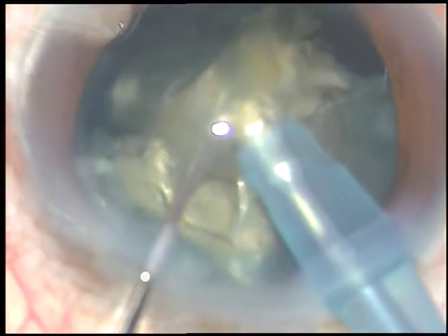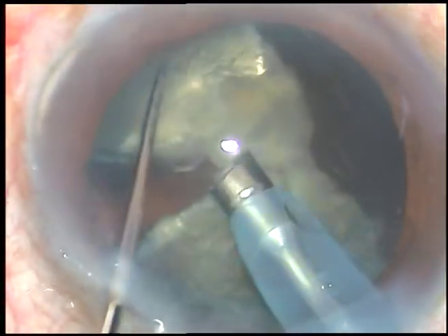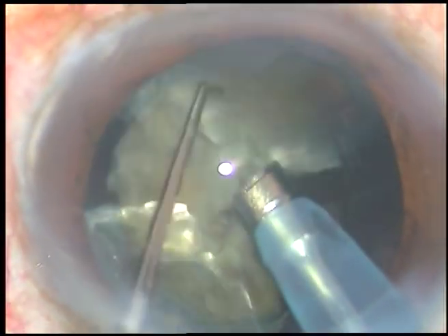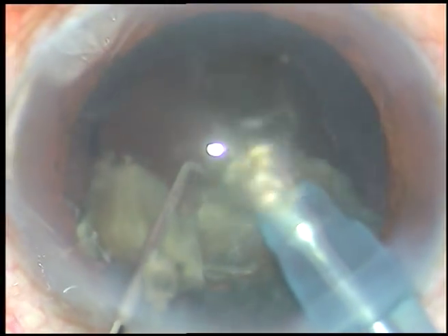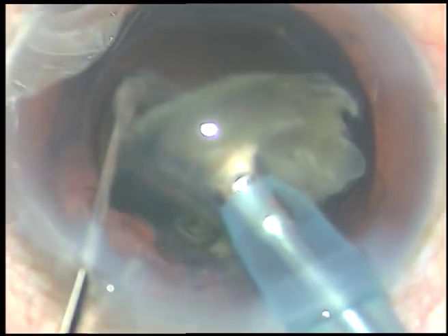In such cases we just have to hold the nucleus firmly with vacuum and chop it. In this case the vacuum is 450 millimeters of mercury. I'm in phaco 2 mode from the very beginning; flow rate being used is 45 ml per minute. Power depends on the hardness of the cataract — in this case the power is 70%.